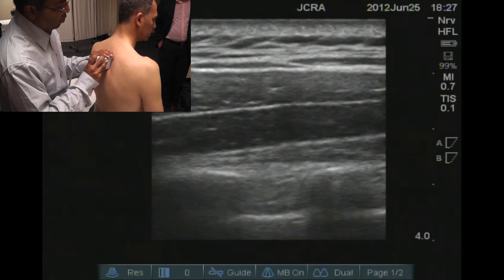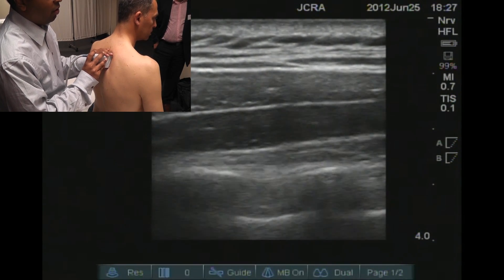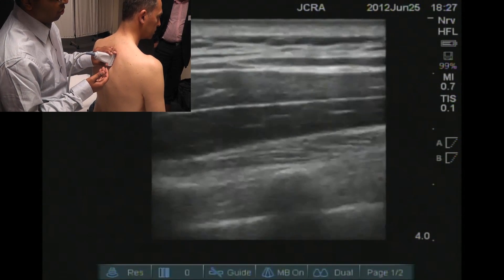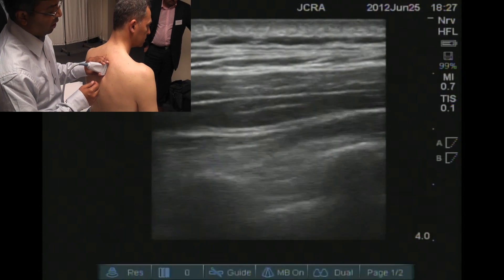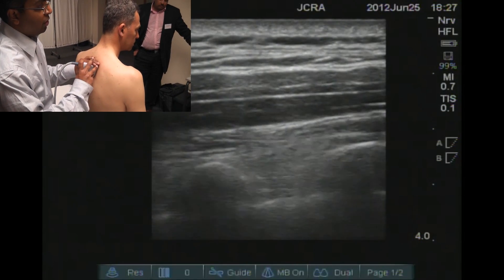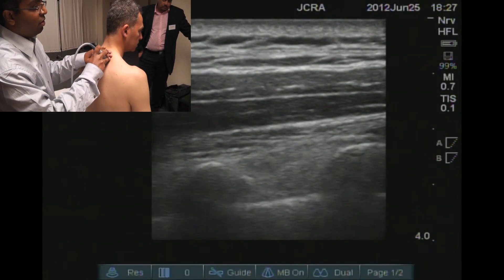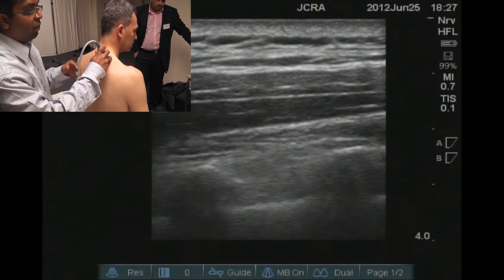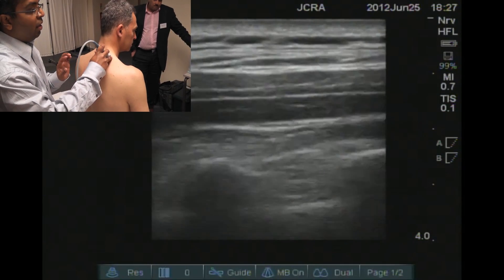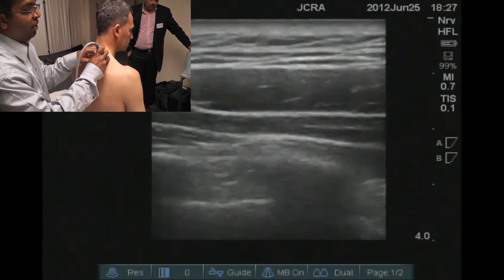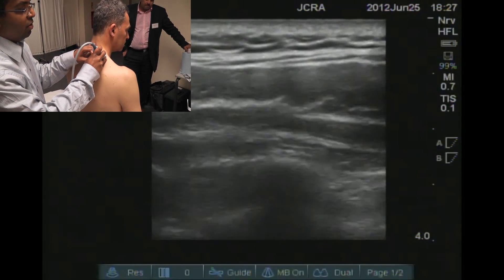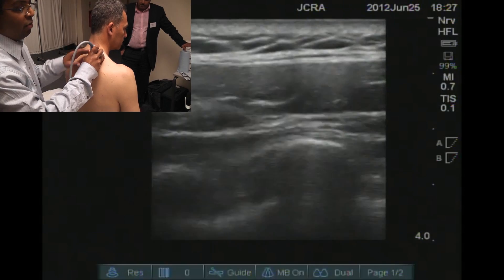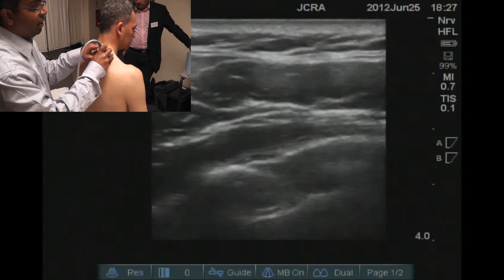Most often we do single injection blocks, so we choose a space about T4, T5. You can count the intercostal spaces. The way to do a paravertebral ultrasound scan easily is to start from the intercostal spaces and work your way closer to the midline.